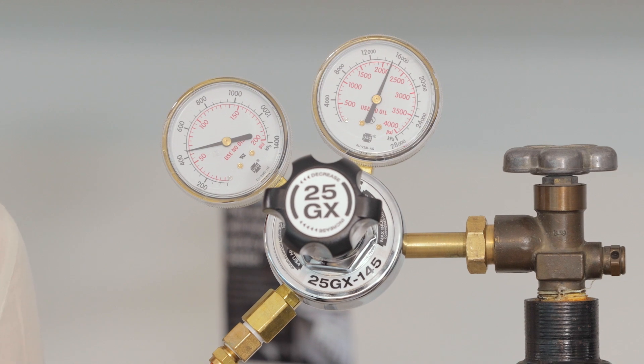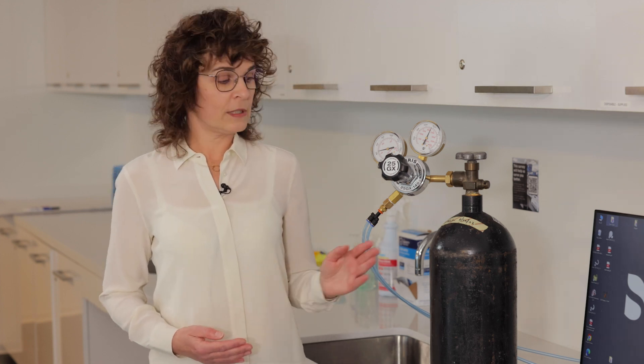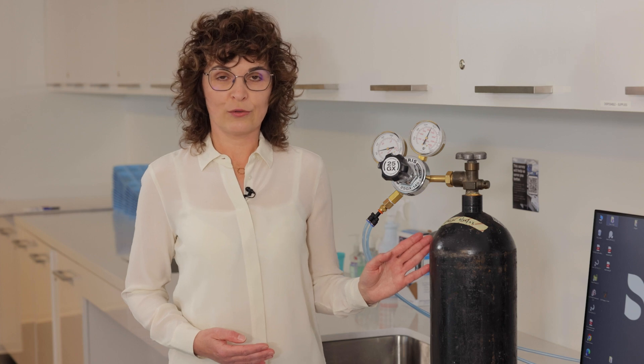The nitrogen tanks come in different sizes. Please contact your local medical gas supplier for available sizes, pricing, and refill information. The most common tank size we use is size E, which is shown in this video.